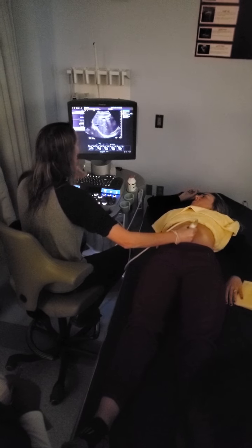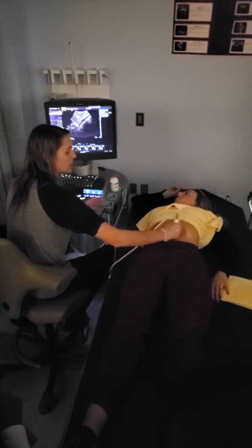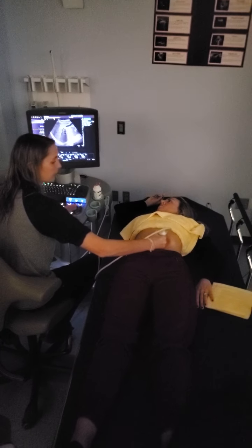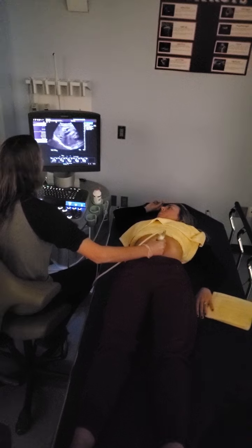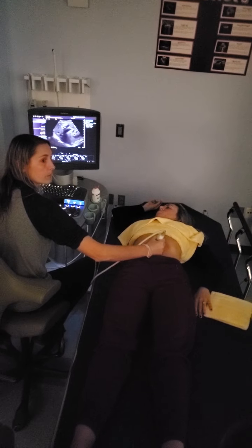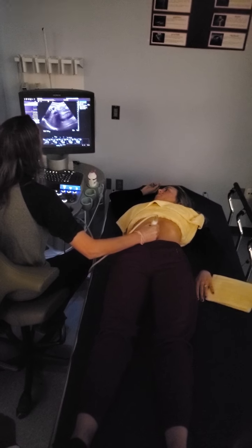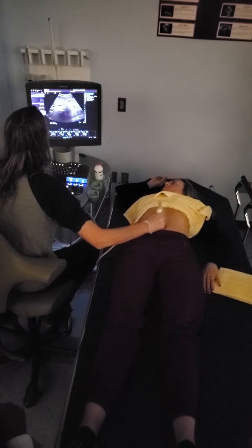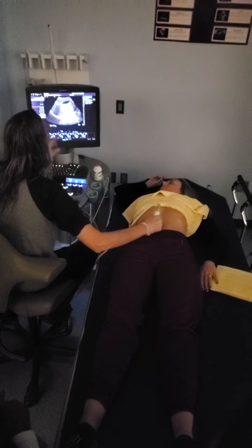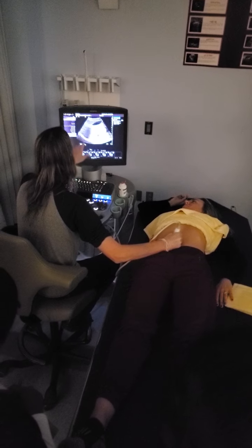Okay, so we did our 4 across the top. We did our medial, we pushed and scooped. Did our medial, our mid-medial, our mid-lateral, and our lateral. And then what do we need to do to see that inferior? Where does my hand need to go? Follow the rib cage down towards the inferior. And when you're ready, big breath in. Okay, so we got gallbladder in the way. He's kind of in our way today, but he'll be there from time to time.